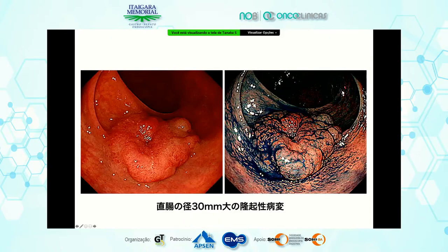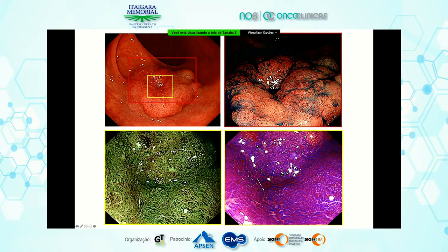How about this? A 3 centimeter flat elevated lesion. Some doctors conduct ESD without detailed examination, but we conduct a detailed examination. The indigo carmine dye spray view shows a regular surface structure. So we do NBI magnification: JNet type 2B.